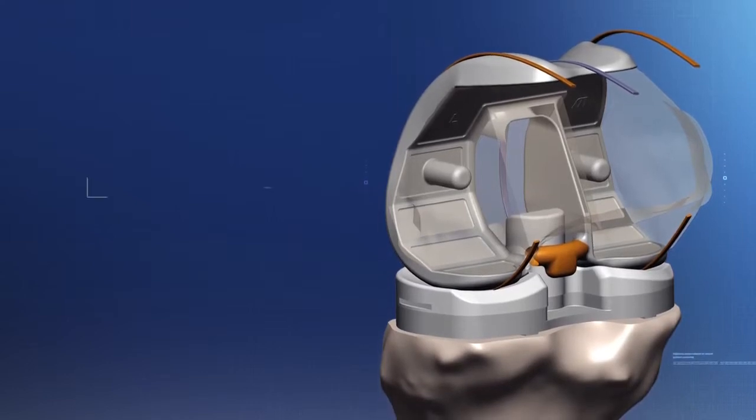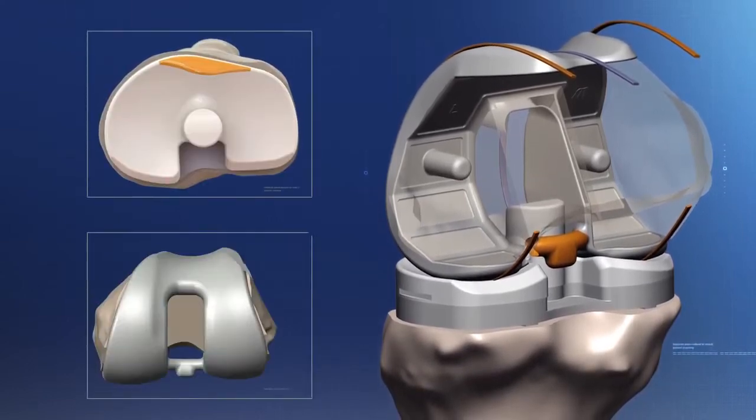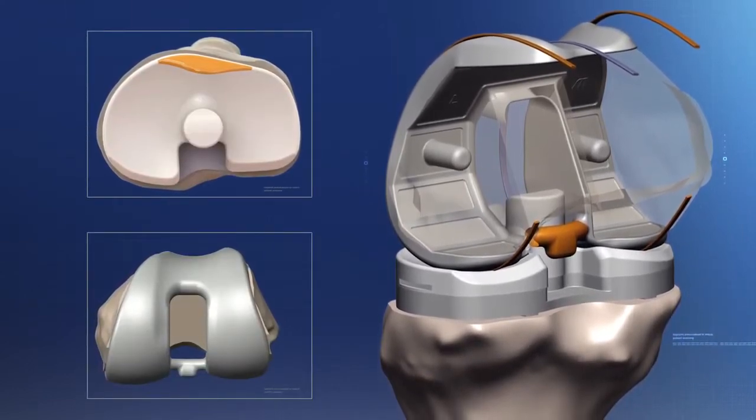With ConforMIS PS knees, there's a variable poly in that too. And there's an inherent stability in the implant itself because of its offset, distal offset and posterior offset, that actually drives how the knee performs. So when you feel that knee, it's going to be pretty rock solid. It's going to be definitely more stable than a round-on flat design.